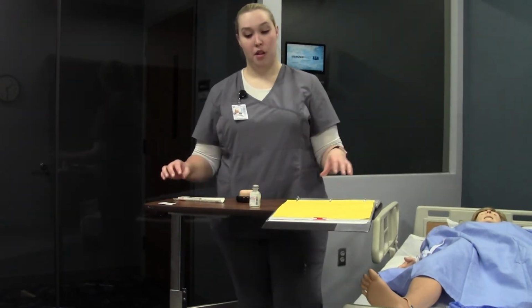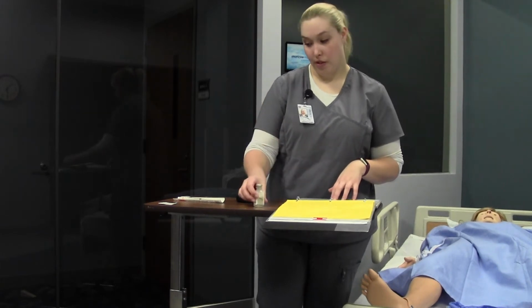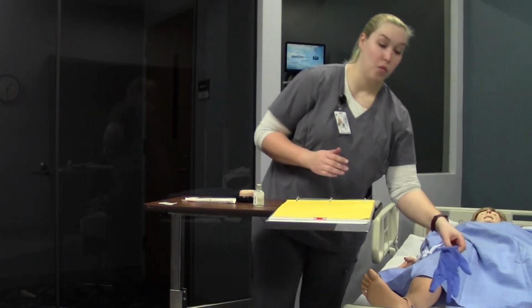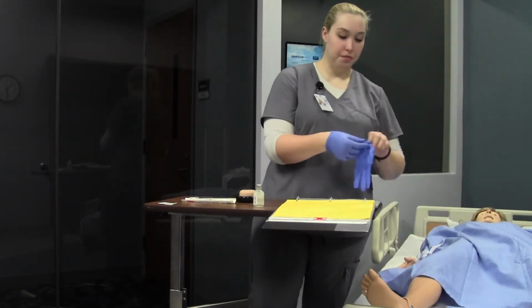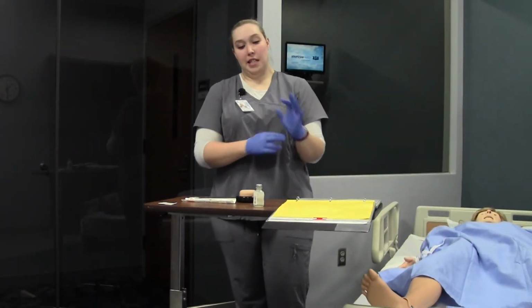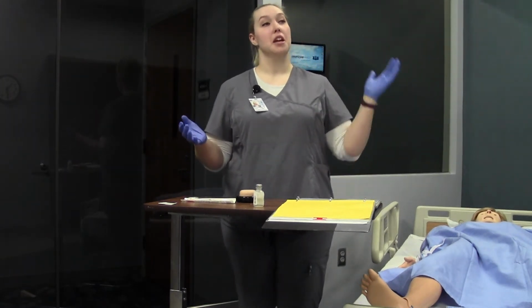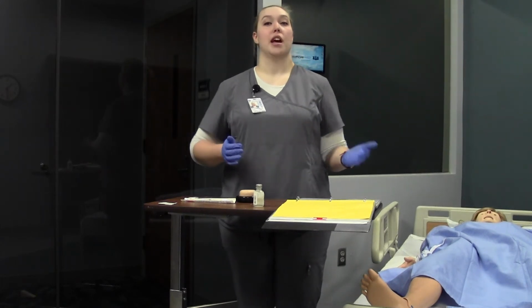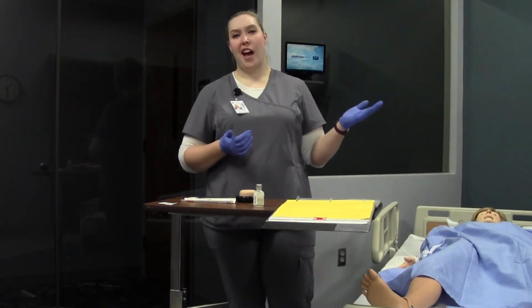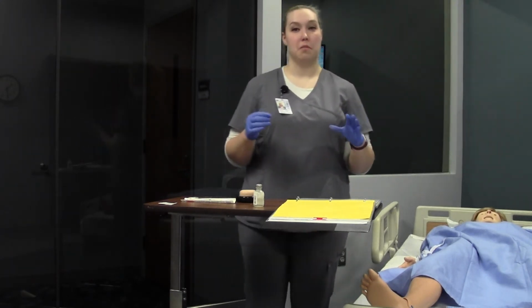Alright, so I'm going to check my MAR again, making sure I have the right medication, it's the right time, get everything ready, all my supplies ready. I'm going to go ahead and wash my hands and put on gloves. Since it is a small dose, I like their deltoid, so I'm going to position my patient in a sitting up position that's comfortable for them and easy for me to get to them. So I would have them sitting up. Semi-Fowler's, high-Fowler's would be fine, and I would put the bed rail down to make sure that I'm not leaning over and it's not going to be in the way.